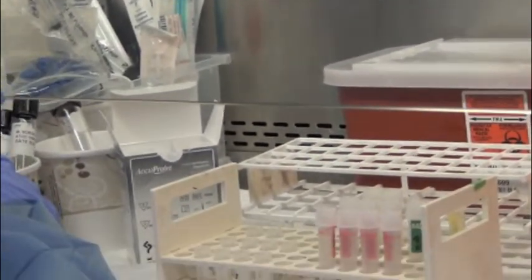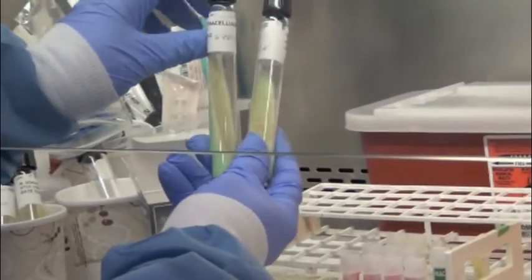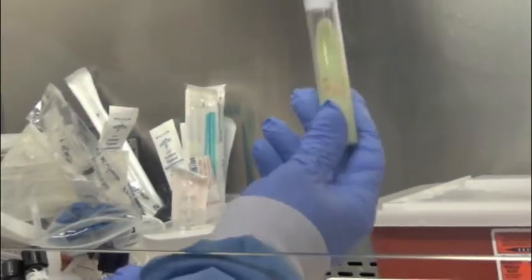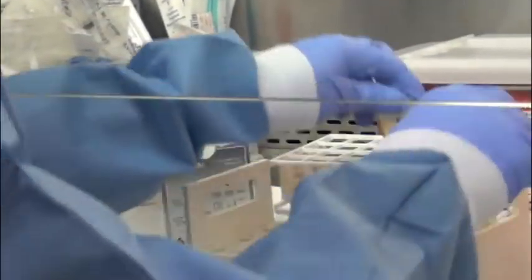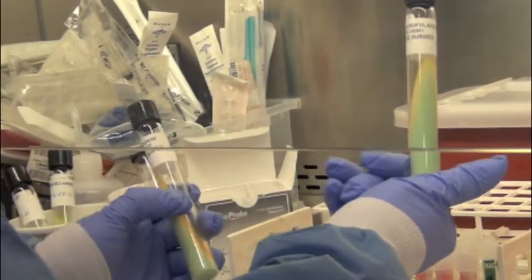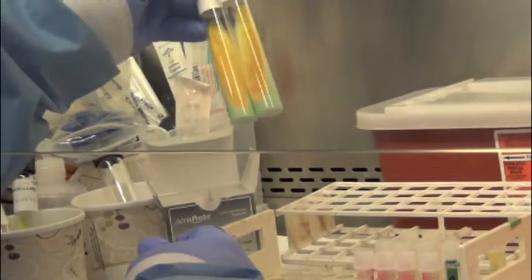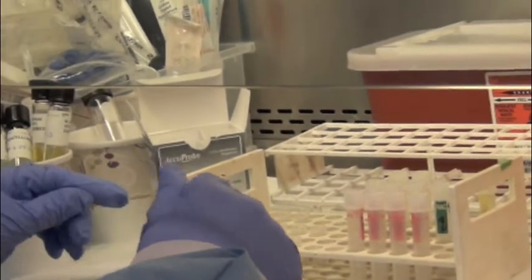Now for MAI, it will be reversed. MAI, Mycobacterium avium intracellulare, will be our positive control, and TB will be our negative control. And for the yellow tubes back here for Mycobacterium gordonae, our control is Mycobacterium gordonae, and the look-alike, Mycobacterium scrofulaceum. By looking at them, they look the same, but the probes are smart, they know.